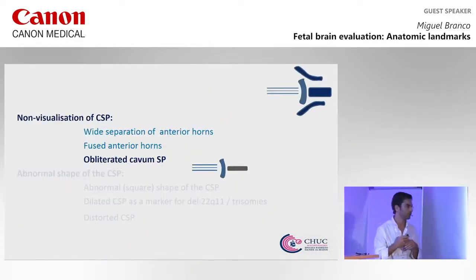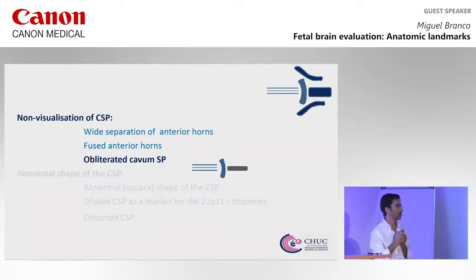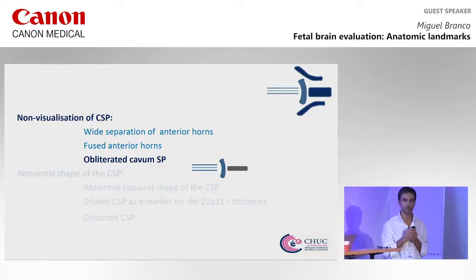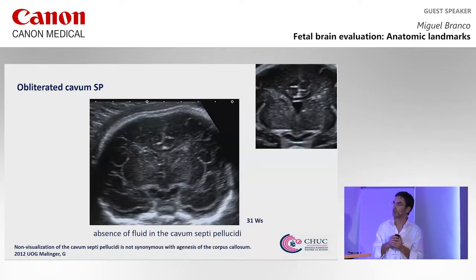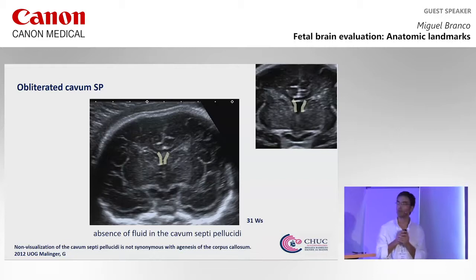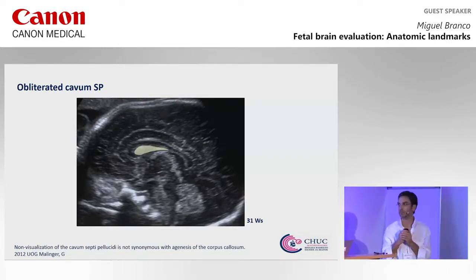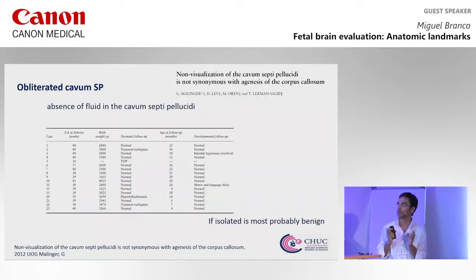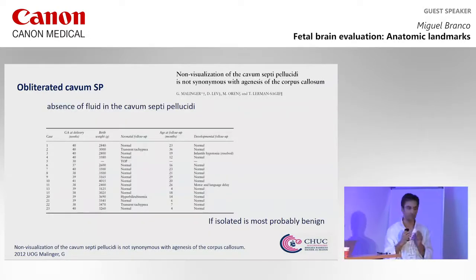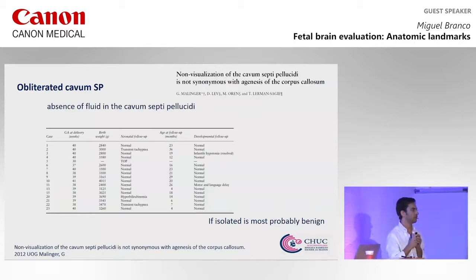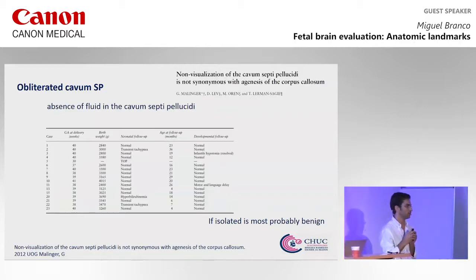Now we come to the last of this group: we are not able to identify the cavum septum pellucidum because it is obliterated. Here we are able to identify the two leaflets and the two septa, but no fluid inside. Sometimes the cavum Vergae is patent. Absence of fluid in the cavum septum pellucidum, if isolated and if everything else is normal, is probably a benign situation as described by Malinger in 2012.